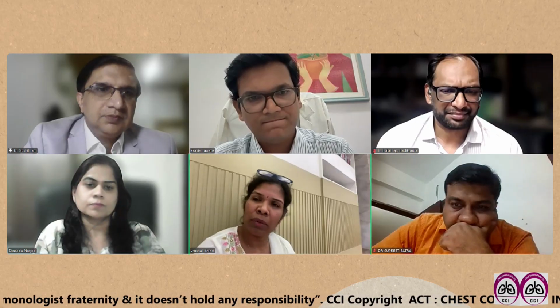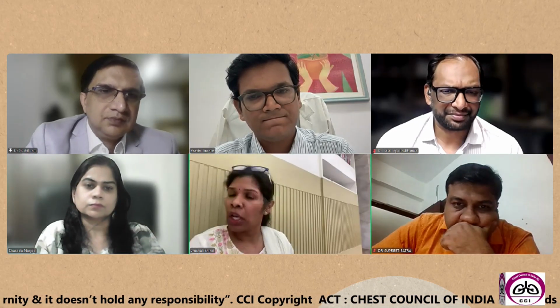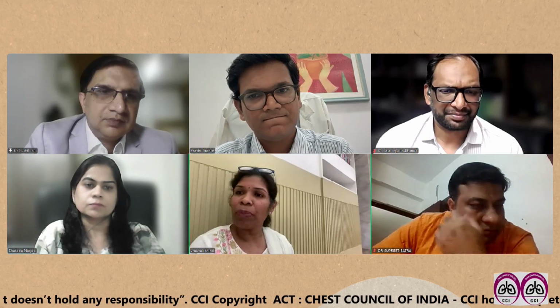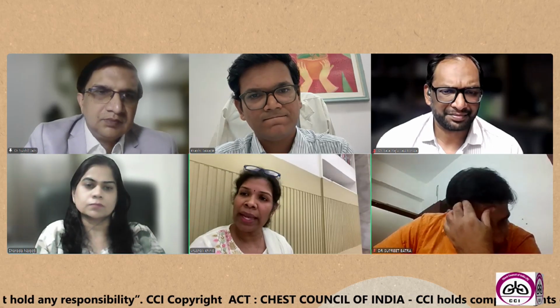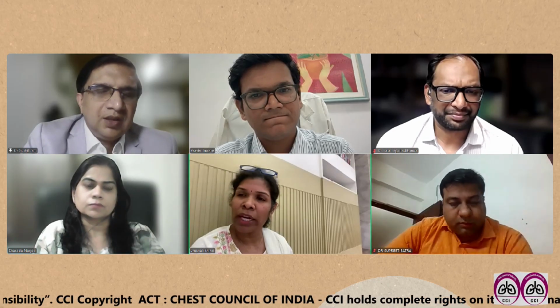Sometimes you get a sample from a necrotic site. If it's necrotic, you can change. Though as a rule we do it, for a person who's a beginner, ROSE will definitely help them understand where they are, if they're getting too many bronchial epithelial cells, or if they're into the tissue.